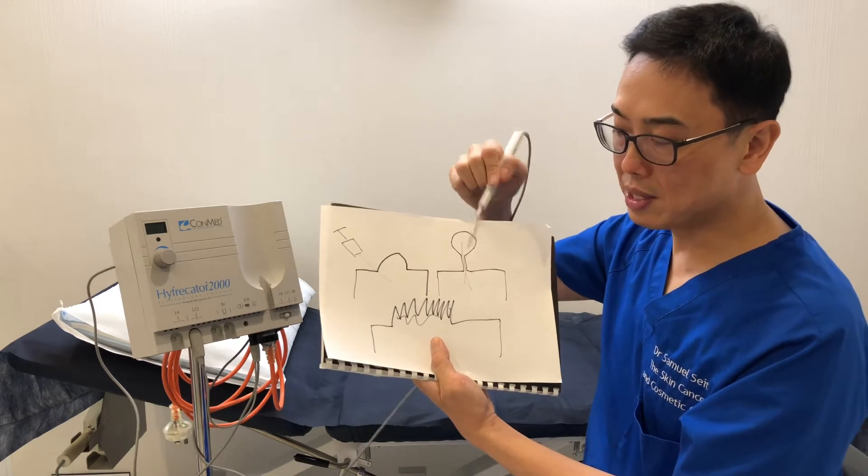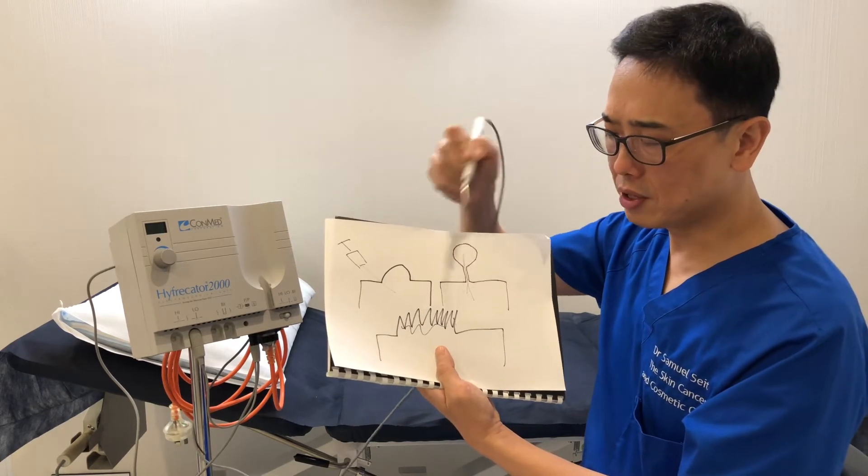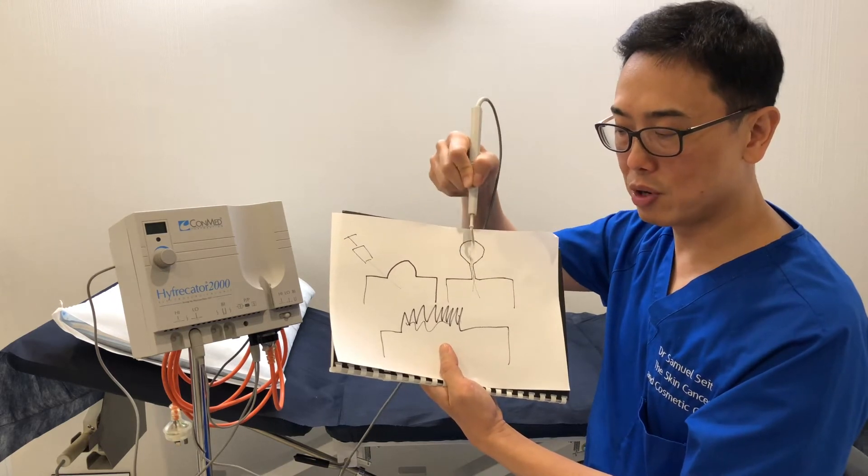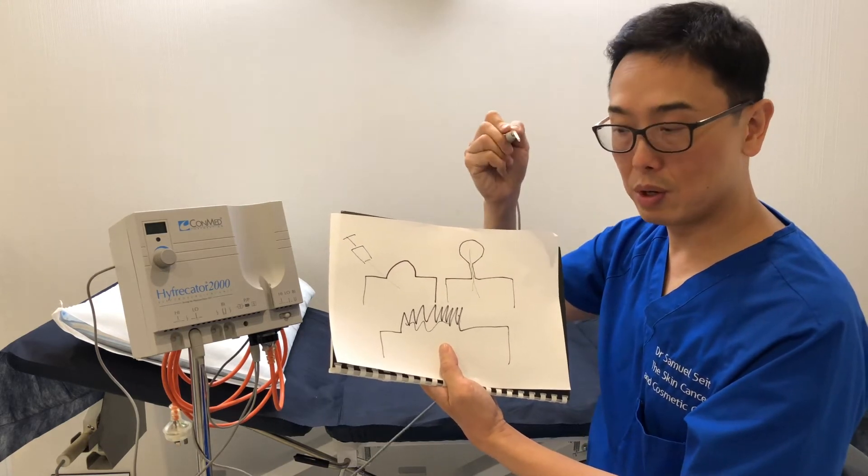As for a skin tag or a papilloma, after it's anesthetized, we use this device — it cuts right through the stalk and it also seals the little artery and vein. So this area is sealed as well.